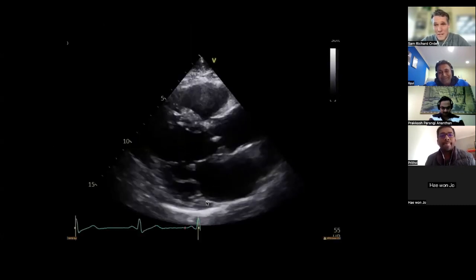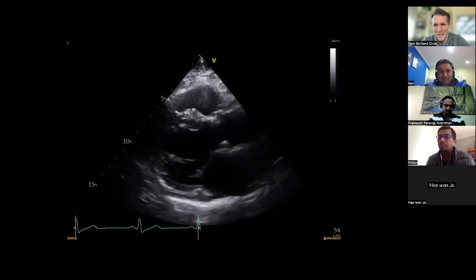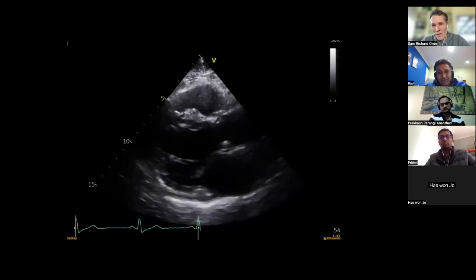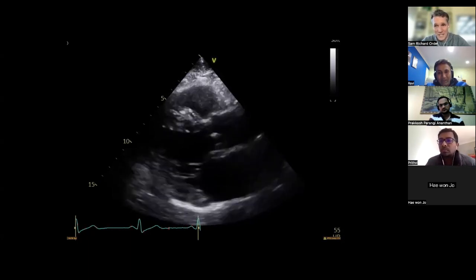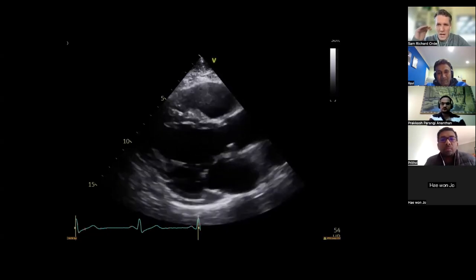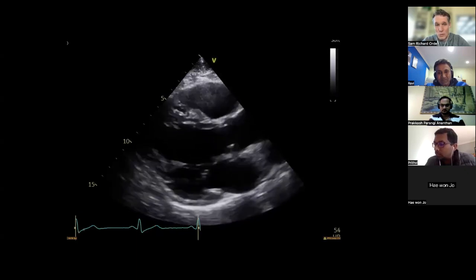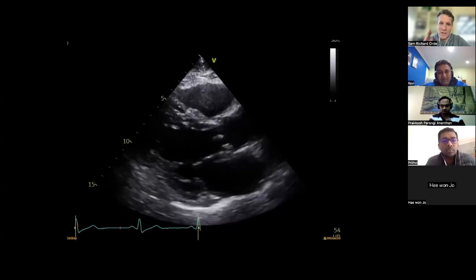So this is a real patient that we had, and I think regional wall motion is really hard. Out of everything that we do, it's probably one of the most subjective things. The most important thing to get through in this case is just your walls, and that's perfect because you're going to be asked about them. It's something that the examiners get very touchy about if you don't get it right. We have a high bar in saying that if people don't get the walls right, they might fail the case. So you got all your walls right. You said those with confidence.